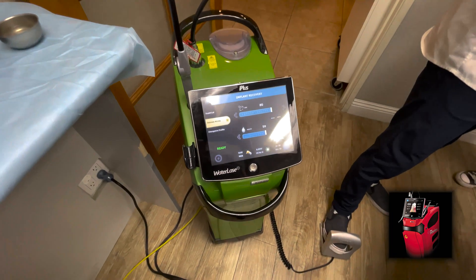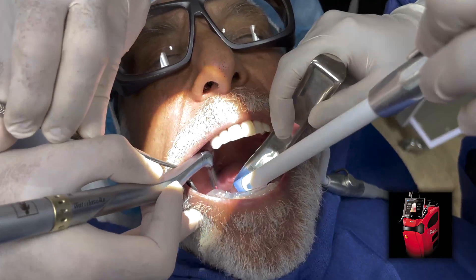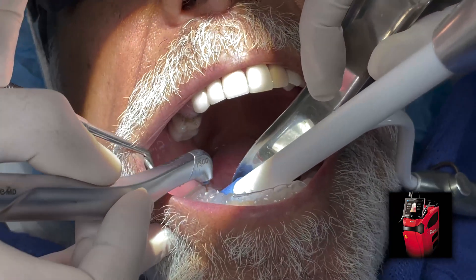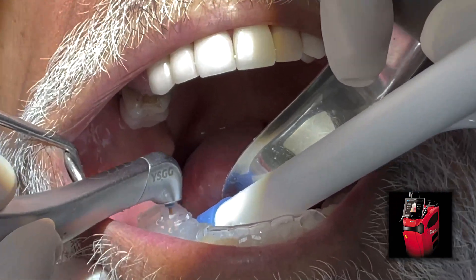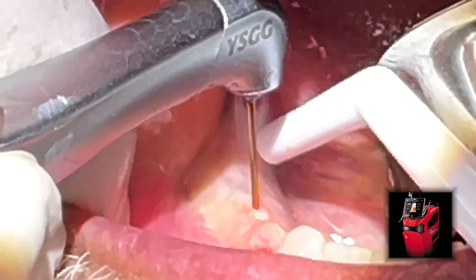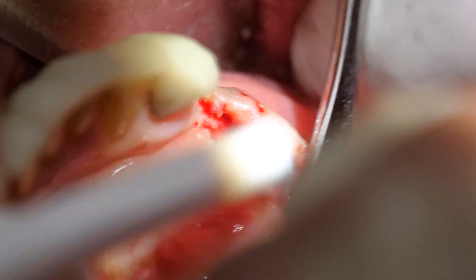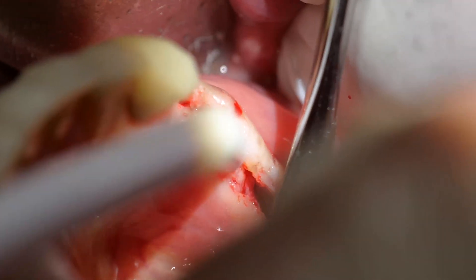As always, a 3D cone beam study is made and a tray is fabricated for the initial osteotomy. Before the flap is laid, the entry points are marked with the laser. After the flap, I also use the laser to create the bone indents to study their locations before using the pilot drill for the first few millimeters.